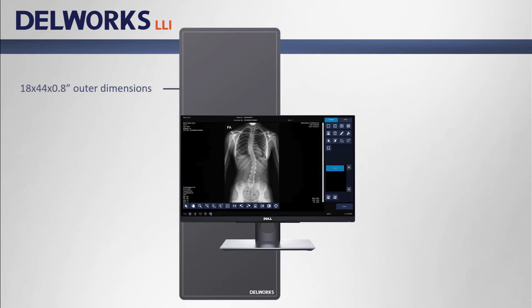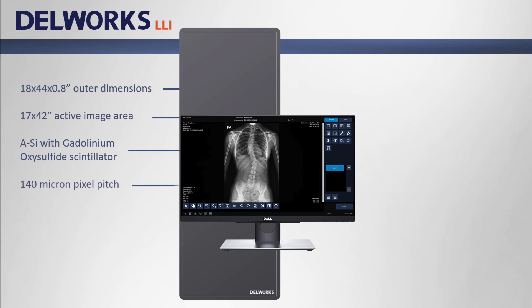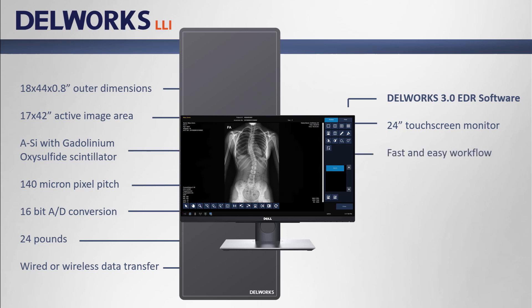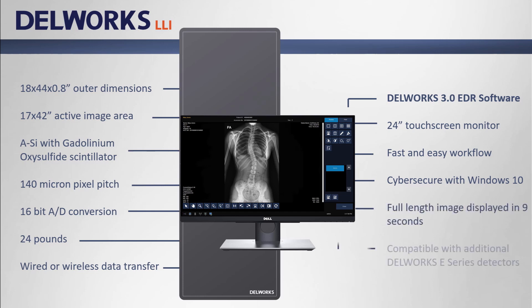DellWorks LLI has an outer dimension of 18 by 44 by 0.8 inches, with an active image area of 17 by 42 inches. The detector is amorphous silicon with gadolinium oxysulfide scintillator, 140 micron pixel pitch, 16-bit AD conversion, and weighs 24 pounds. It's available with both wired or wireless data transfer and is powered by DellWorks 3.0 EDR software. Images are displayed on a 24-inch touchscreen monitor, with fast and easy workflow, cyber security with Windows 10, and full-length images displayed in 9 seconds. DellWorks 3.0 is compatible with additional DellWorks E-Series detectors.